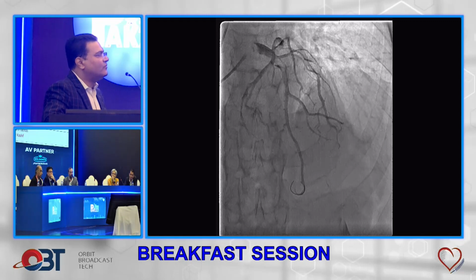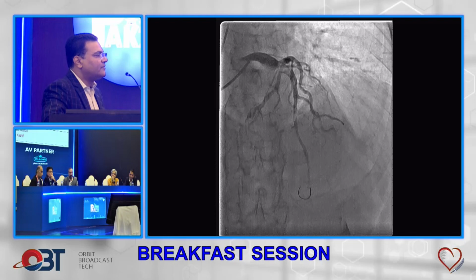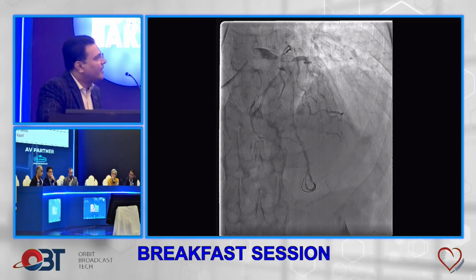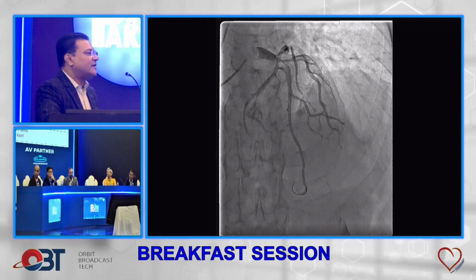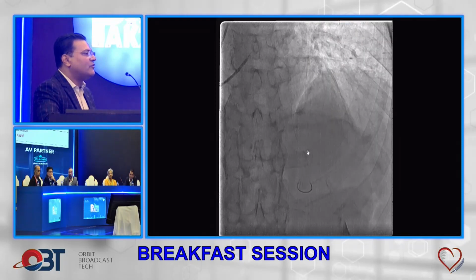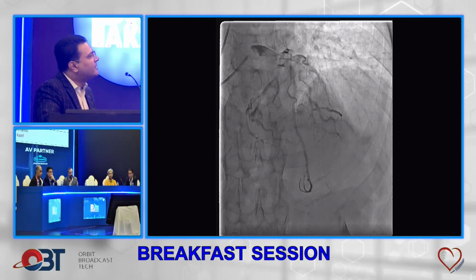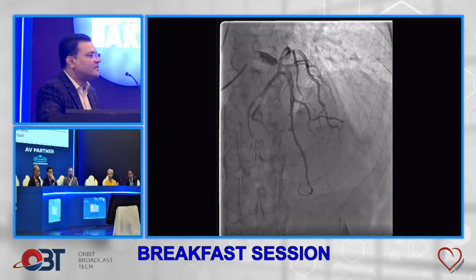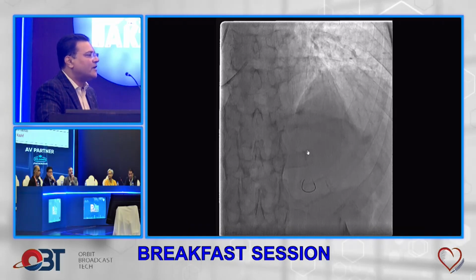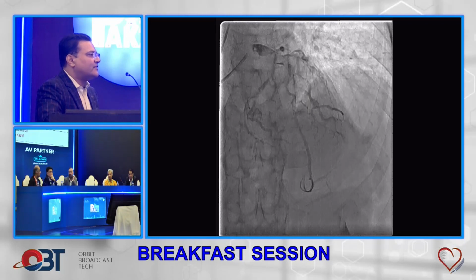So this was the flow. Again, there is a huge clot burden. But at night, in the primary CathLab, the maximum size of the stent I had was 4.0 and the balloon was 4.5 or 5 maximum. Here, the size of the vessel is about 8 to 10 and the aneurysmal size is about 14. So, what to do? Which stent?